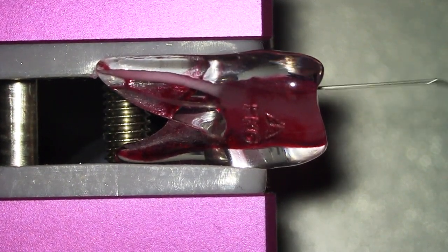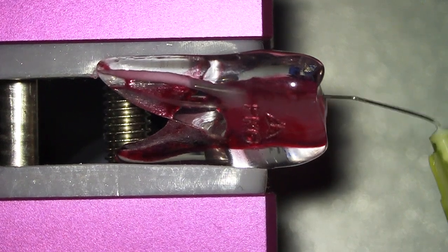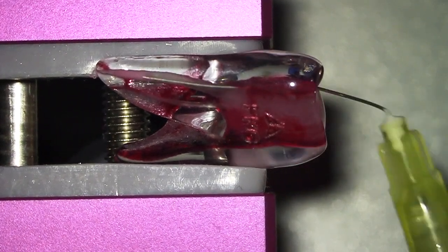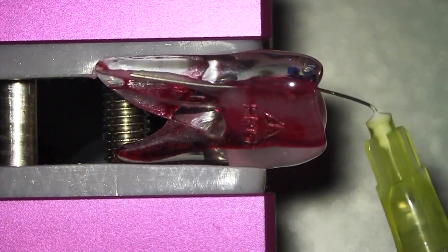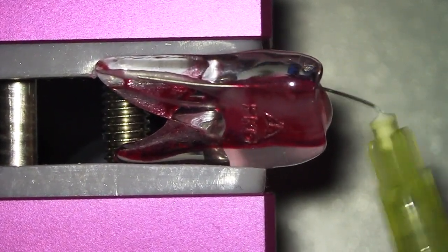Irrigation is a must after instrumentation. Notice the debris accumulating in the apical part where the tip of the needle cannot be placed.